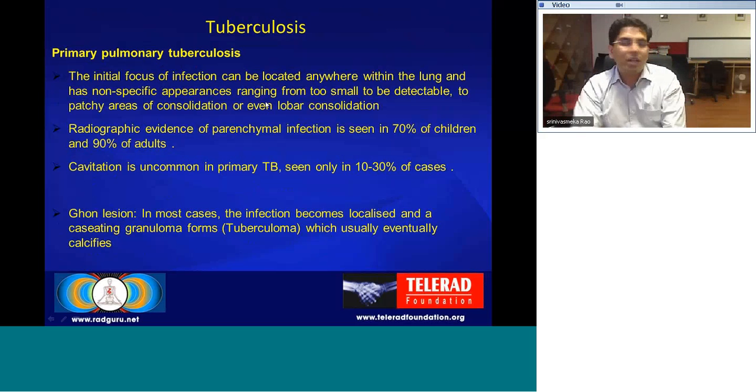So moving on to the next topic, tuberculosis. You all know it's primary pulmonary and post-primary tuberculosis. I'll go through some of these slides, and at the end I'll show a tabular summary of these two tuberculosis forms.